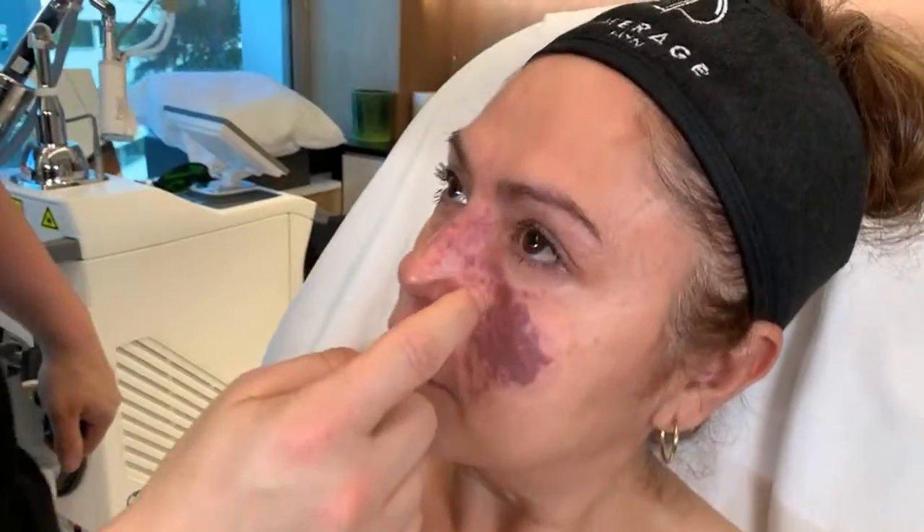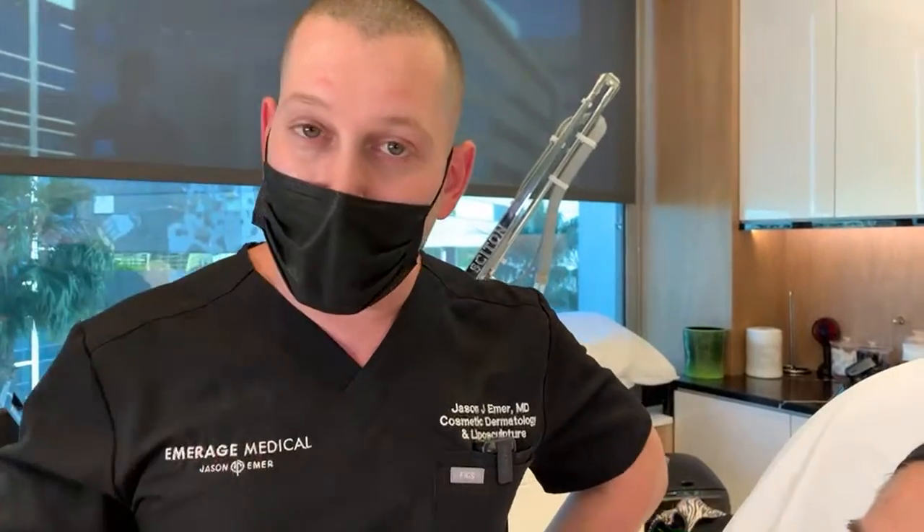The number one question was about pain — those are tears of joy, not tears of pain. It is a little painful because you can't really do a lot of numbing — topical numbing constricts the blood vessels and you don't want that. You can see how much darker it's getting, which is really good. She can use fusion shield sunscreen and cover with tinted SPF or makeup. Cover FX is one of the first companies that came out with medical grade cosmetic camouflage — you can get it at Sephora. There's also Dermablend.